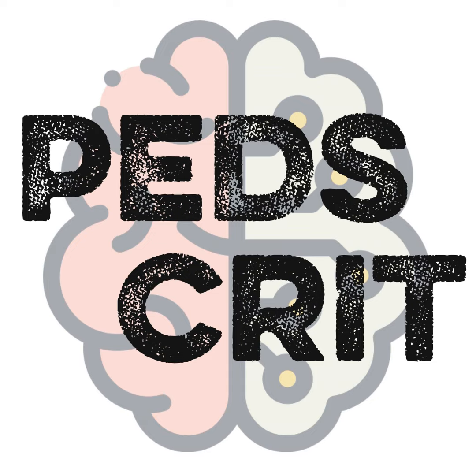Yeah. And then do you have a cutoff on the highest mean airway pressure you would recruit to before you call this patient a non-responder? The limit of the device is our cutoff. That's amazing. That's awesome. What's the highest? No, but many people get worried when we are approaching 40, 45 centimeters of water. But in some patients, that was necessary. So it's mainly the limit of the device that limits how high we can go.